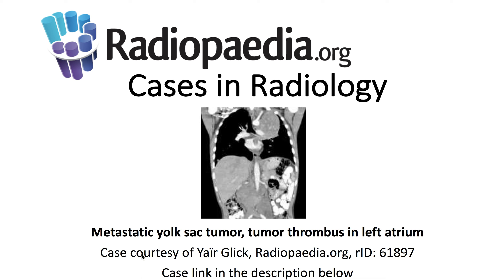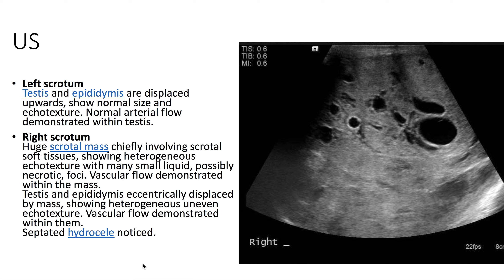On ultrasound in the right scrotum, we see a large scrotal mass involving scrotal soft tissues with heterogeneous echotexture and many small liquid, possibly necrotic, foci. The lesion does demonstrate vascular flow on Doppler ultrasound.